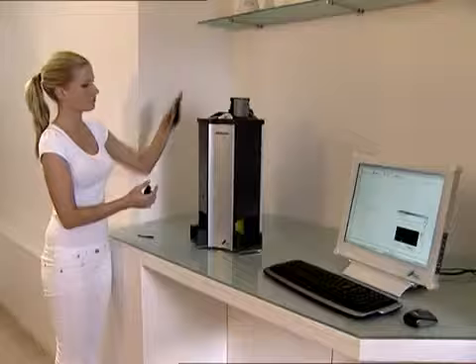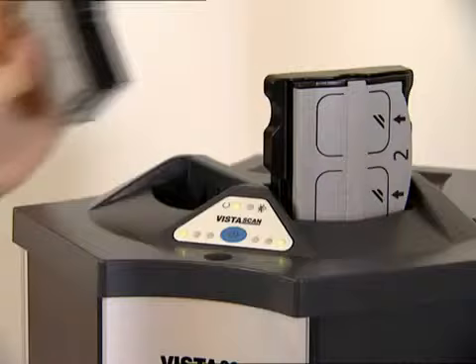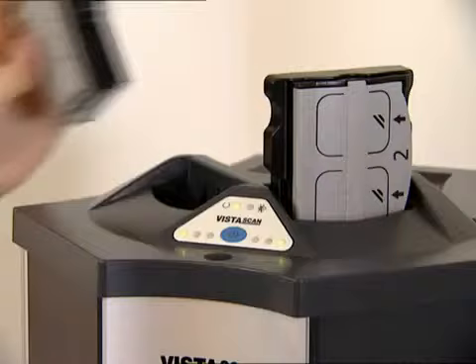The wide exposure tolerance is very forgiving with regard to under or over exposure of the x-ray image. The Vista Scan Perio multi-slot scanner can process up to eight image plates in one single step.